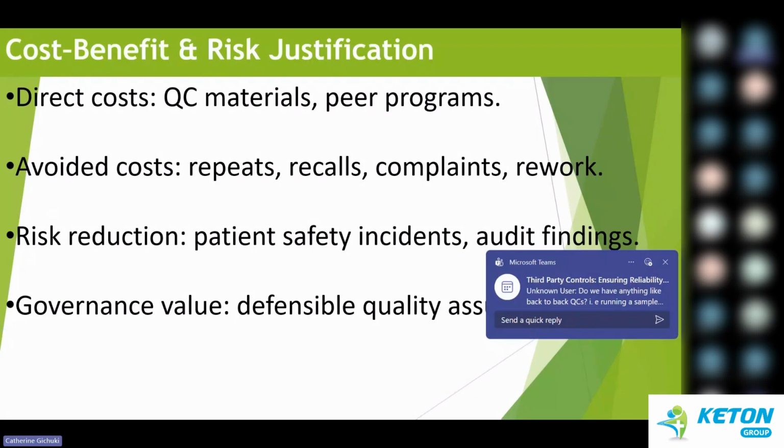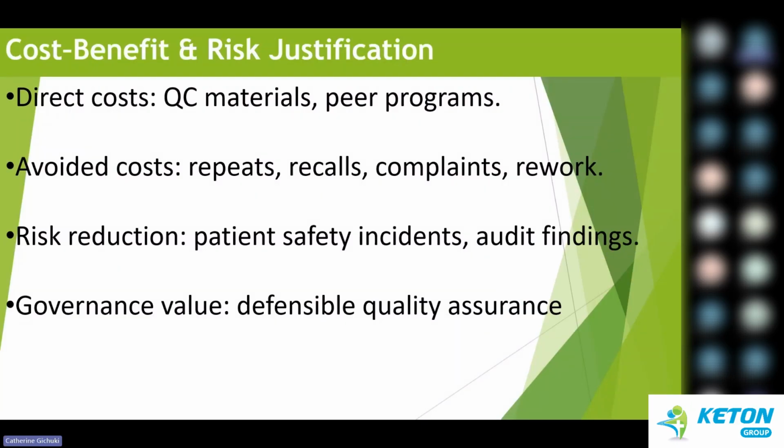Then we have costs that you are avoiding. You're avoiding repeats. When you do a QC and you're sure of what you're doing, you avoid repeats, you avoid recalls, where you're recalling results, you avoid complaints and reworking. You don't want the doctor calling you to ask about your QCs, which also helps them doubt you. You're supposed to be sure of what you're releasing. So you don't want to repeat every run or rerun every question somebody raises. That is also a cost that you're reducing.